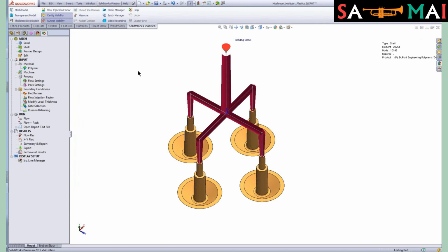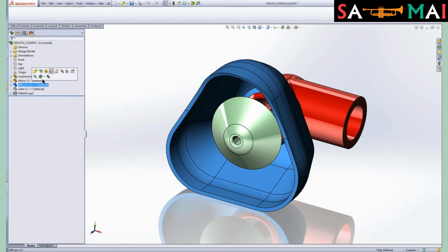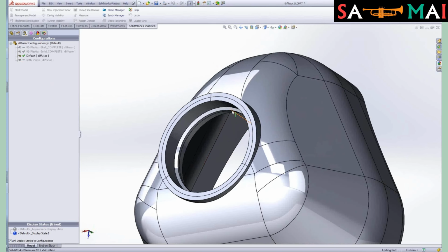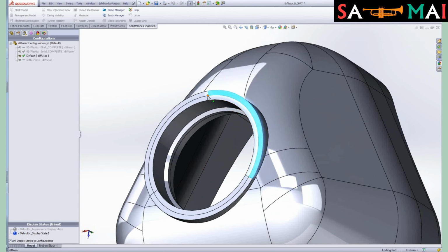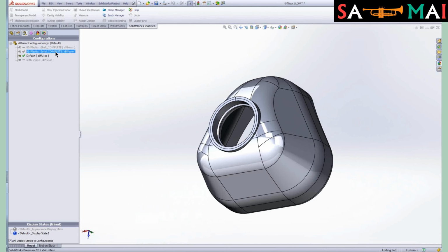All right, let's go ahead and exit out of this, and let's take a look at a little bit more complex model. This would be the diffuser. So now I've pre-prepped this particular model by putting a split line on this face, and what we're going to do is basically put in gates at these 3 locations. So let's go ahead and start.